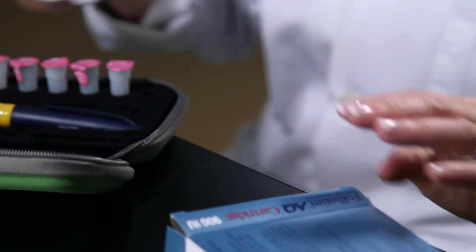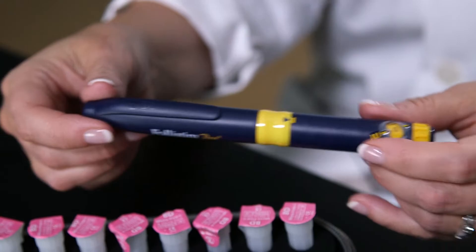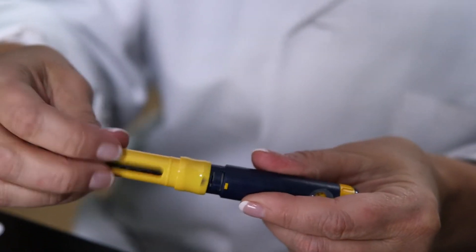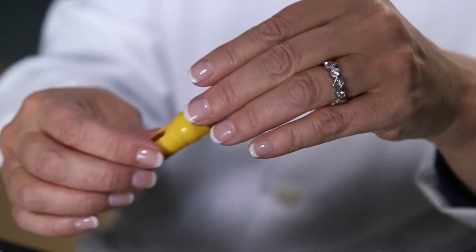Remove the tray from the box. This is your Follistim AQ cartridge. This is your Follistim pen. Remove the cap from the pen and take the pen apart. The Follistim AQ cartridge is dropped into the yellow part of the pen, metal band first.